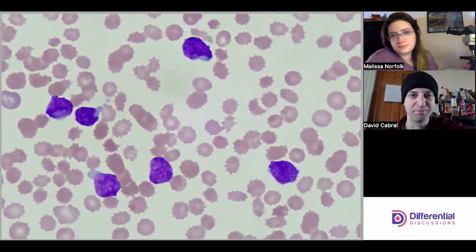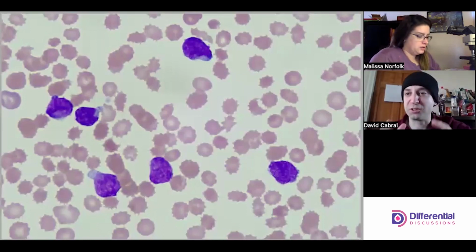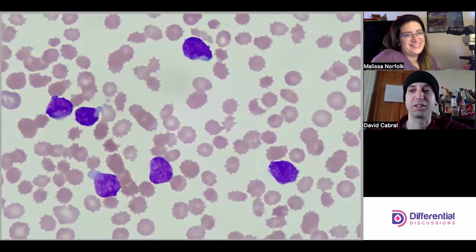Agreed. So take what they give you, right? Not every morphological scheme is going to line up neatly. Take this particular patient's presentation, use those details, and apply it as you go. I say it all the time, but be ready to reset your diff and start over again when you discover more things.